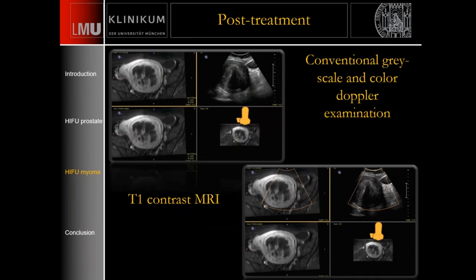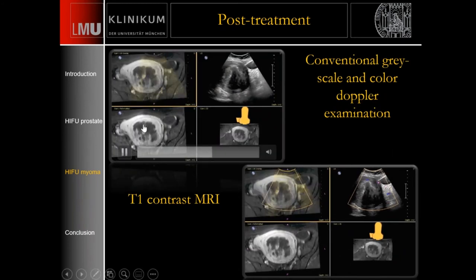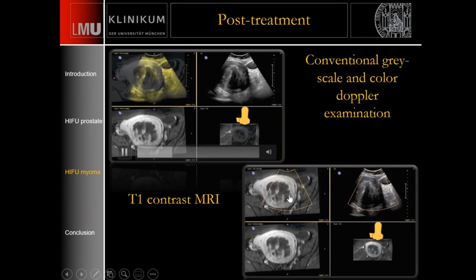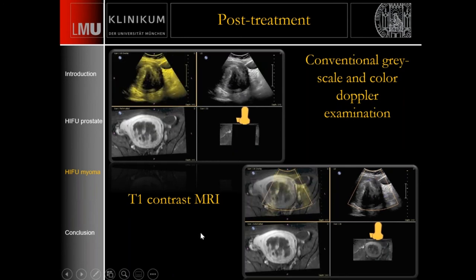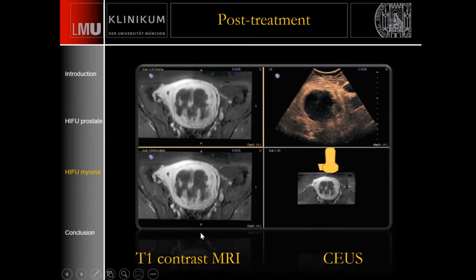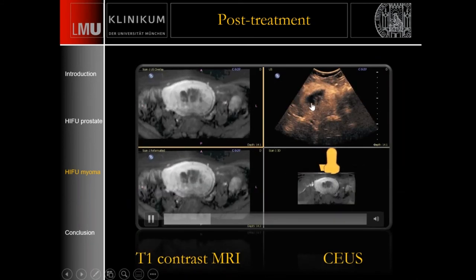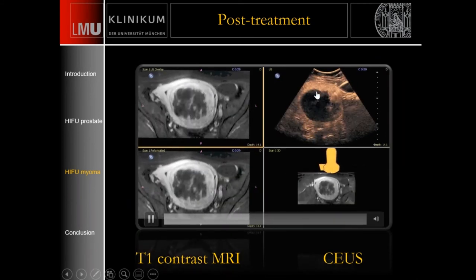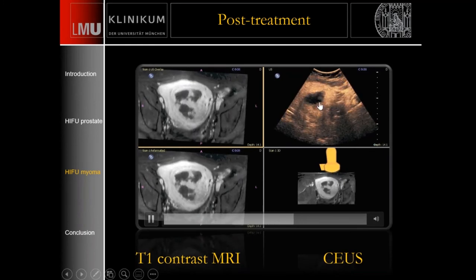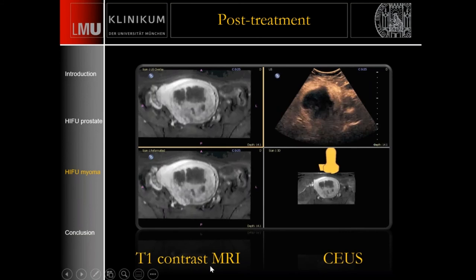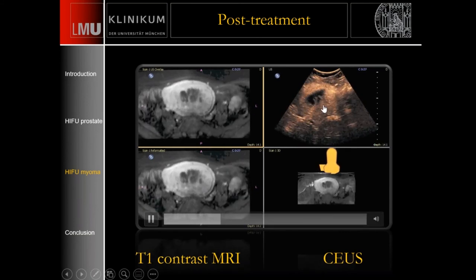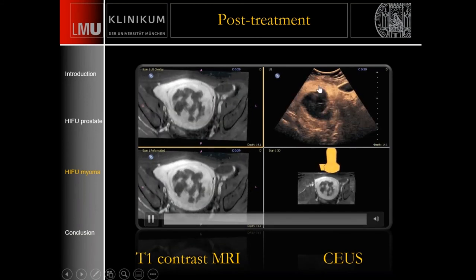In the follow-up examination, there is already some necrosis visible on MRI. In the grayscale images there are no major vessels inside. With contrast, a large necrosis is visible after MRI-guided HIFU therapy. Over time, this necrosis will continue to shrink.